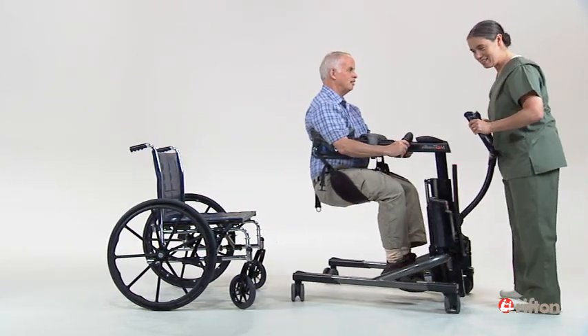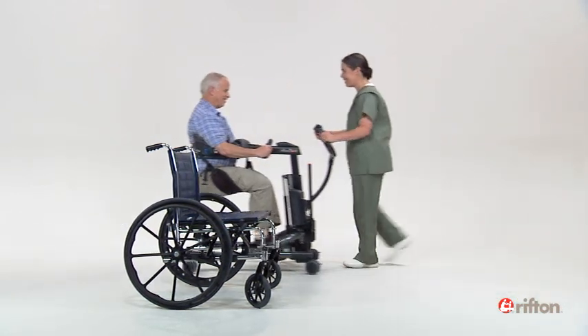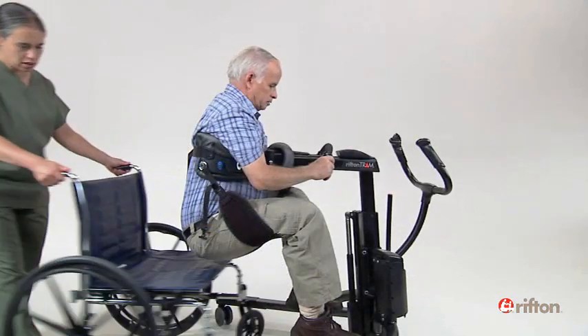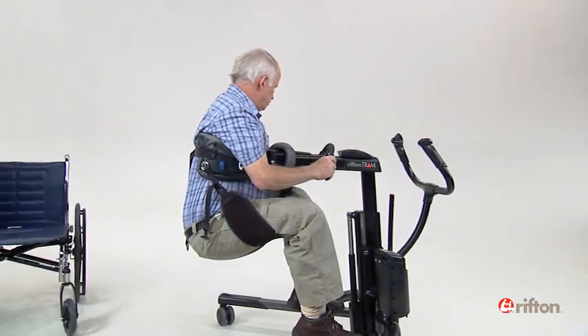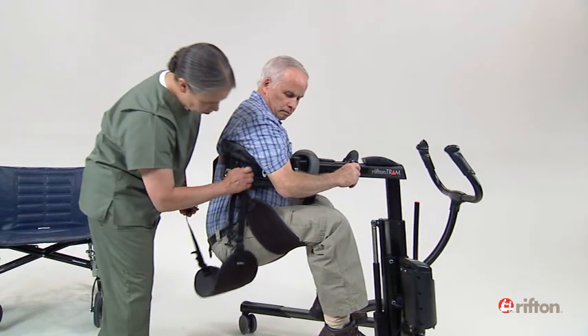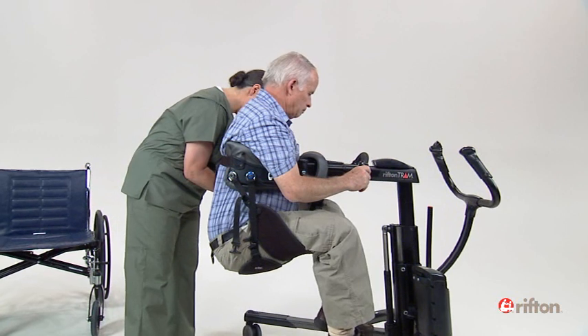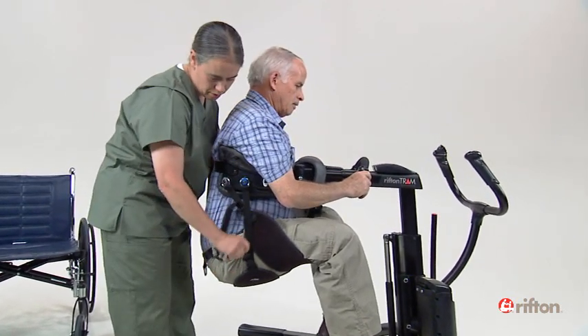When your client is positioned properly, the thighs should be parallel to the floor. If your client still sags uncomfortably even after adjusting the thigh straps, take a third thigh strap and place it under his seat as shown here, pulling the adjusting straps snugly from behind.